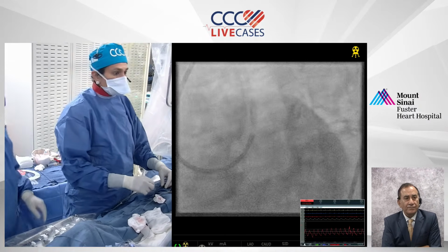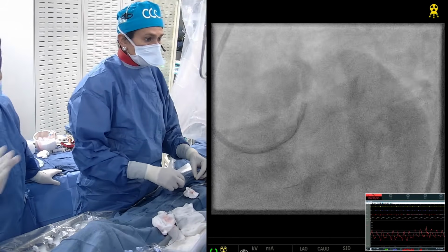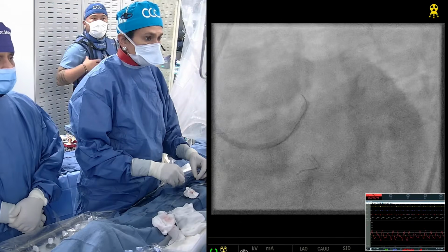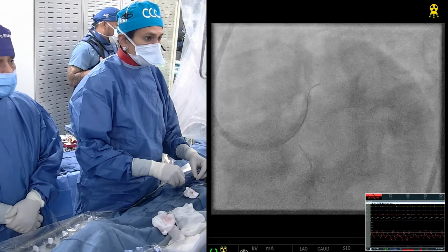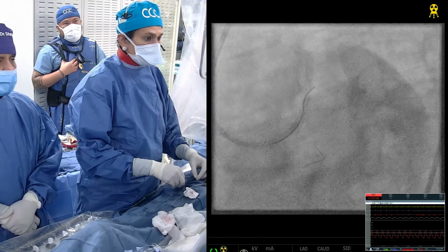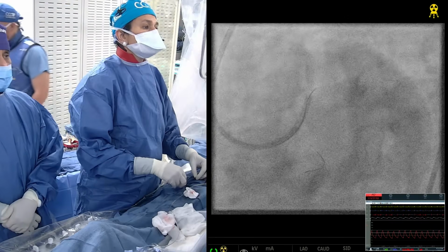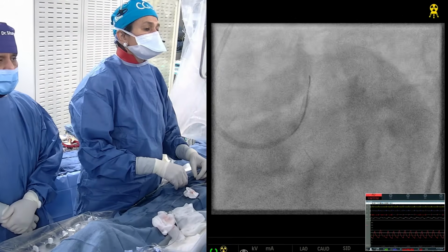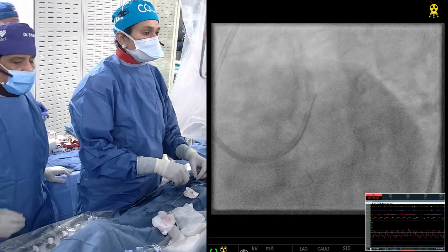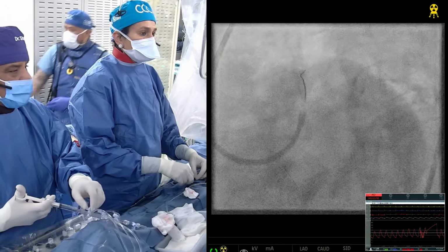Yeah, so that's a very good point. The question here is that by changing the direction of the wire, you may be able to do more ablation, kind of becoming a little orbital atherectomy rather than just rotational. In the short lesion, I think it's probably less important, but yes, from time to time we do pull back the wire, and the idea is that you are changing the direction of the rotor burr and, with the wire bias situation, trying to ablate different areas. But in the longer lesion, yes. The short lesion is very straightforward.